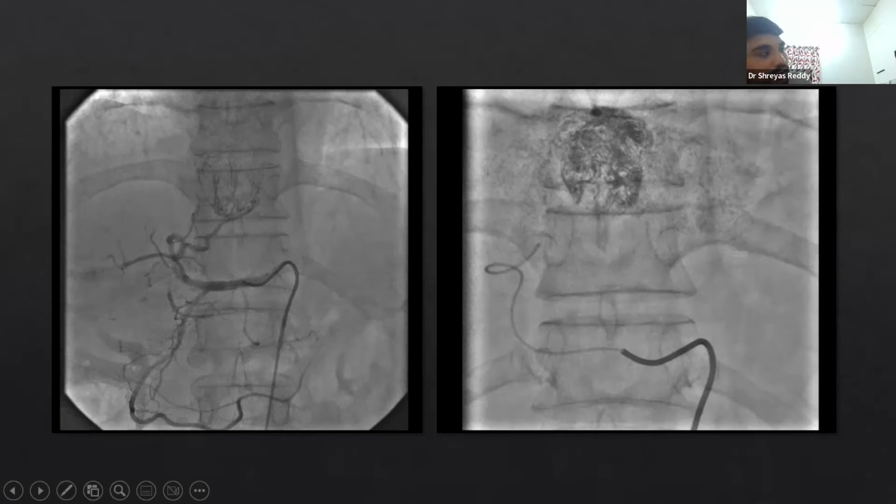There is one very peculiar thing you are seeing in this image, Shreyas. Can you make out what is not there in this image? Do you see the right hepatic artery? You're not seeing the left hepatic artery. So what is the arterial variation that you would expect in this patient? Where would the left hepatic artery arise from? It can arise from the left gastric artery. Yes, exactly. So the segment 4 artery is coming over here. Sometimes in some patients, the left gastric artery can give rise to the left hepatic artery. So that is a variation seen in this patient.